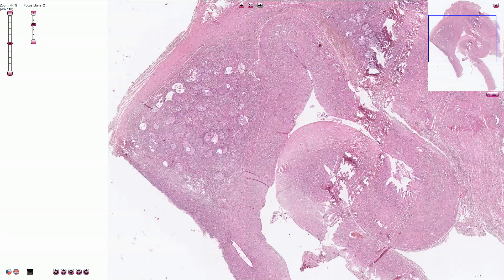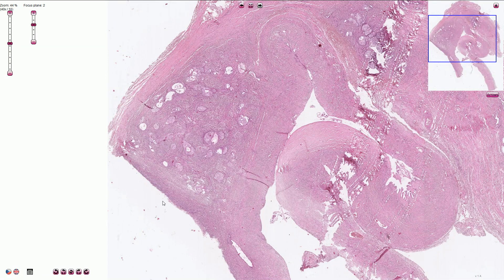Brenner tumor is a benign epithelial stromal tumor of the ovary with nests of transitional type epithelium embedded in the fibromatous stroma. It is usually solid as we see it here, but it can also be associated with other cystic tumors, and that's what we see here.